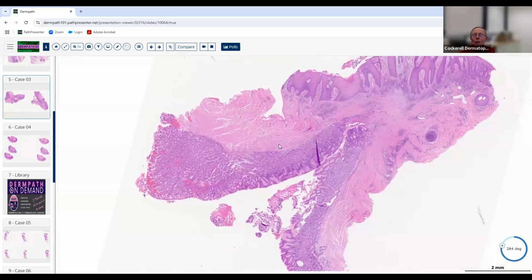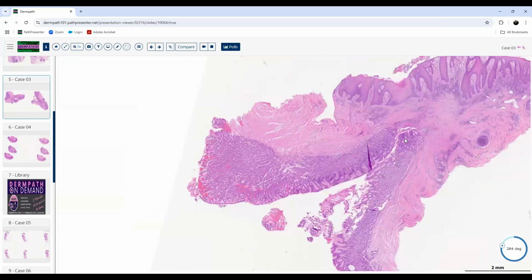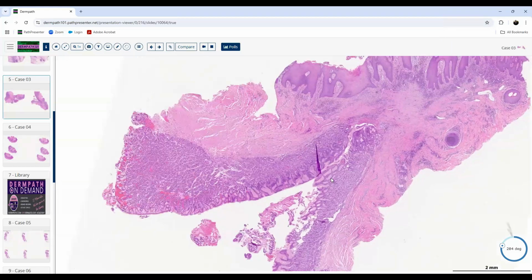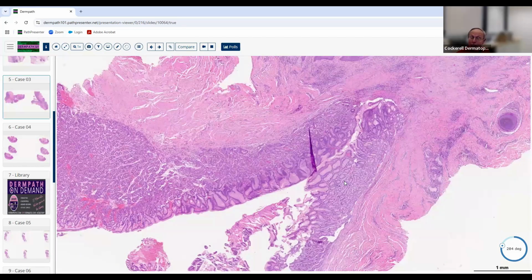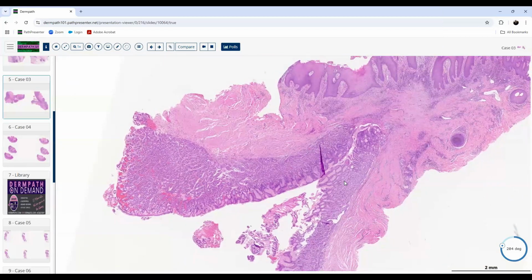And so what do you think they were concerned about when they took this biopsy from an adult in this situation? This wasn't a baby. This was an older person. Like that could be a malignancy? Yeah, they were probably worried about that. What malignancy do we often see in this setting in that umbilicus area? Is it a man or a woman? Could be either one. Could be like metastatic colon?